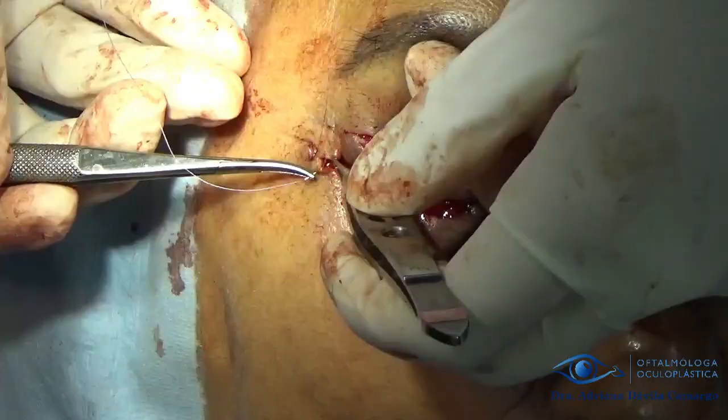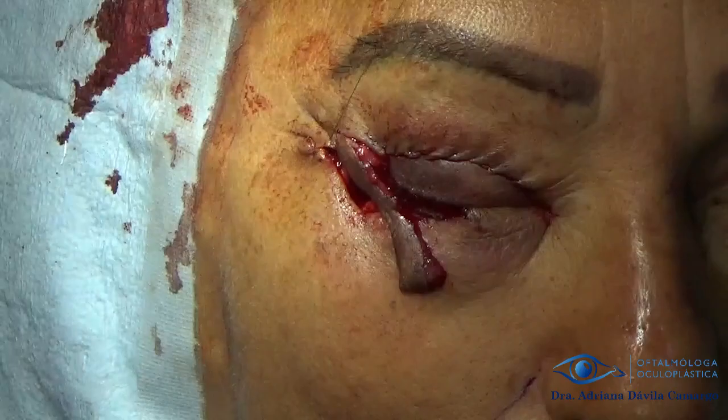We use a malleable retractor to protect the globe and proceed to close the defect. In post-operative care, you must leave an ointment with antibiotic and anti-inflammatory and patch it for a few days so that it makes contact with the vascular bed.